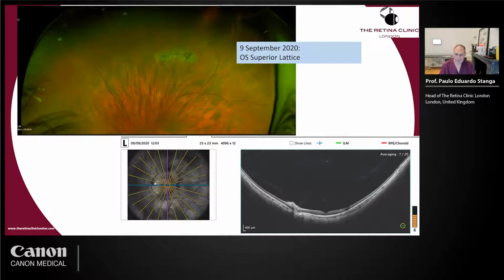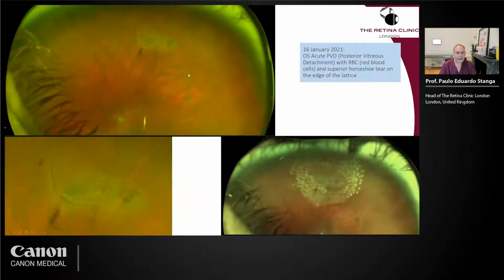So she rings me a month and a half later, 9:30 p.m. on a Friday. I say, come on Saturday morning. And you can see there is a large tear that ruptured even the blood vessel along the edge of lattice, which we could easily treat.